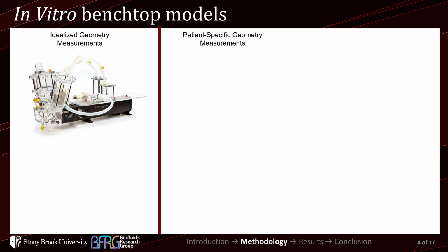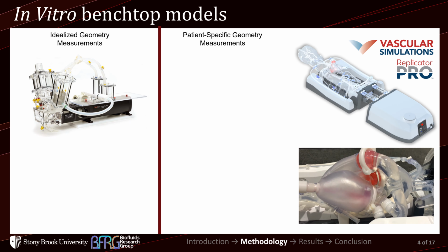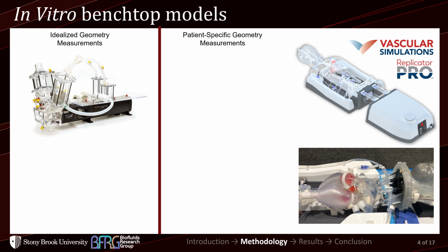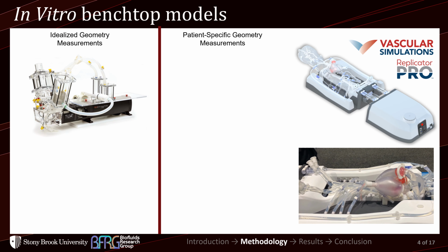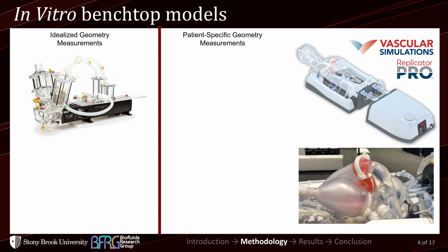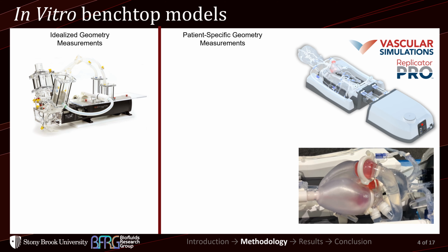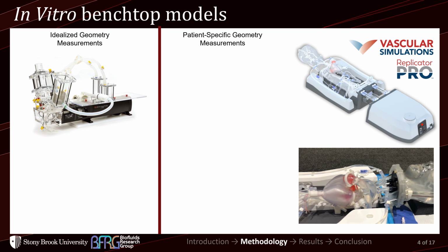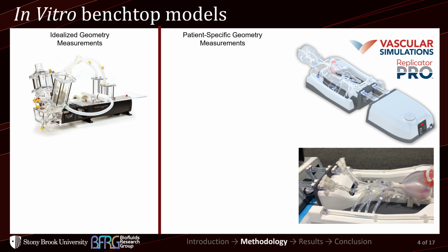So from my research and working with this local company in Stony Brook University called Vascular Simulations, we came up with a patient-specific simulator called the Replicator Pro, seen here. It contains all the major vessels, all the major arteries inside the body, as well as realistic and physiological flows, including control over the cardiac output, the blood pressure, and independent control of all the flows throughout the anatomy.